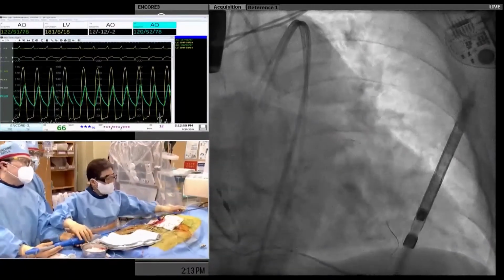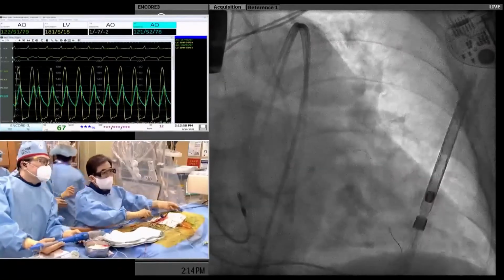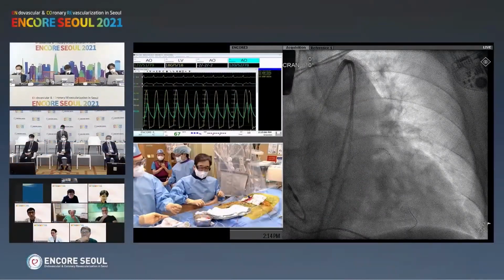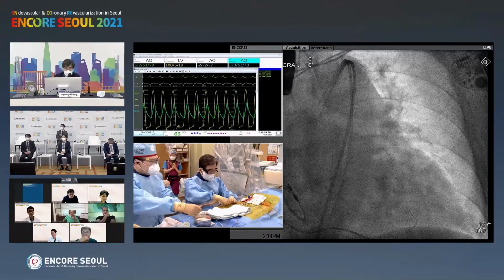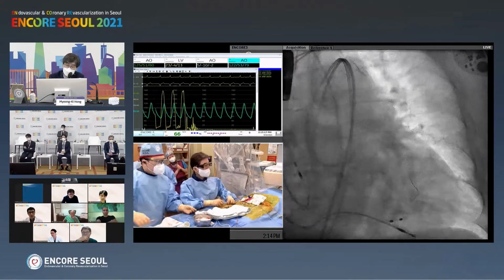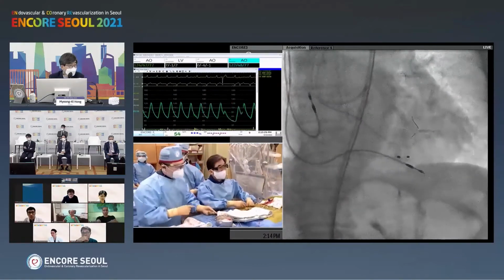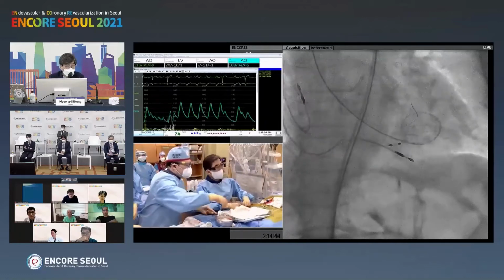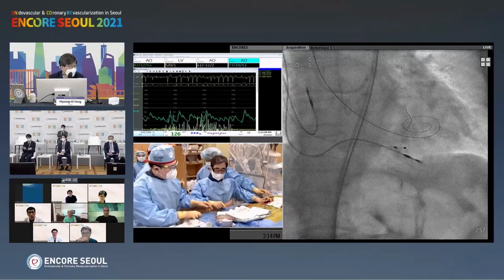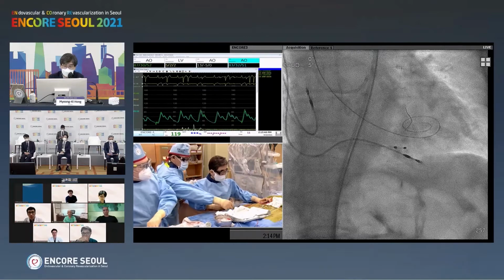Coronary obstruction, actually the incidence is rare, but it occurs. It is a real catastrophe. So the principle is, first one is try to predict, and if there is some suspicion or possibility, then we try prevention by the coronary protection, even though the possibility is small. In most cases we will do the intervention without coronary protection, even though there is risk. But you know that among 100 or 200 cases, one case of coronary obstruction is really painful. So always try to avoid any minimal risk of it. So that point of view is the coronary protection.